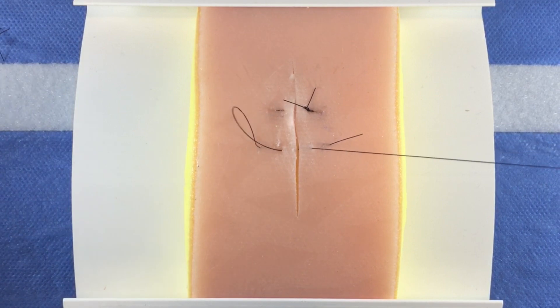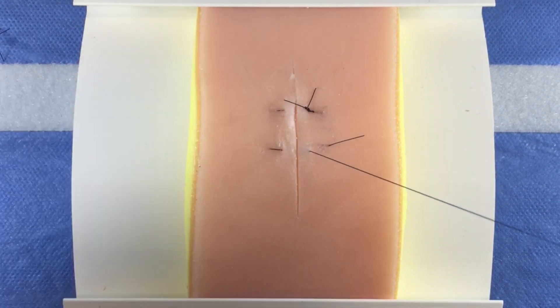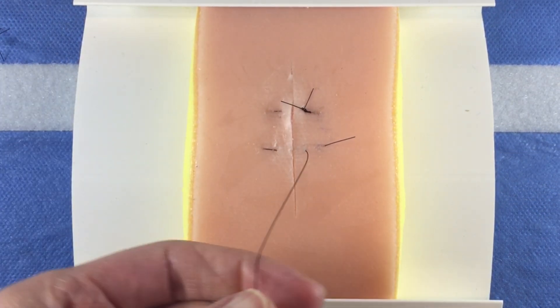Again, take care to ensure that the depth and distance from the wound edge is the same on both sides.